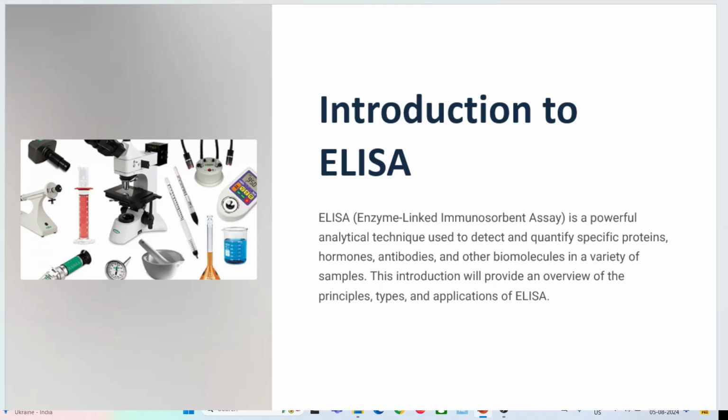And this antigen antibody interaction, we are conjugating it with a secondary antibody again, which is having an enzyme along with it. And this enzyme of the secondary antibody reacts with the substrate to give the colored product. In short, we have an enzyme linked antibody which indirectly gives the proportionality of the antigen present in the given blood sample. So how exactly do we do it?